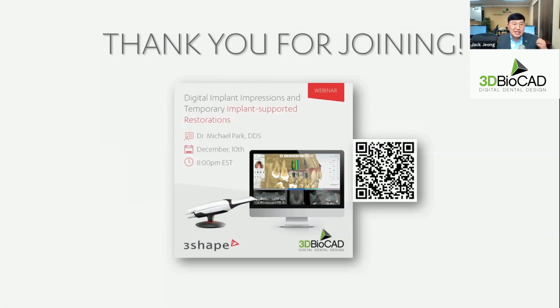Of course, all the CBCT viewer functions are going to work for you. But maybe I need to tell you a little trick today. Implant Studio will ask you to import the surface scan too, but you can just import any kind of surface scan. Then you can ignore the aligning work and use Implant Studio as a DICOM viewer only. Yes, it works. Okay.